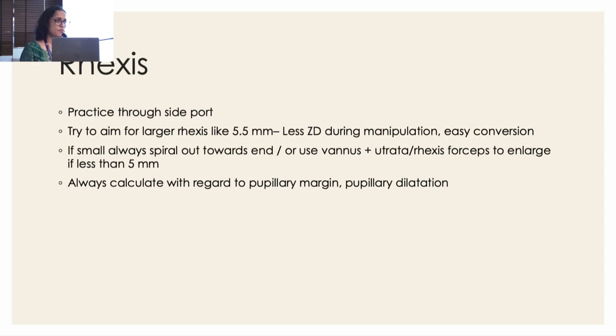If the rhexis is small, like less than 5 millimeter, never proceed, enlarge it with Vannas or rhexis forceps or Utrata. And always calculate the rhexis size with regard to pupillary margin, pupillary dilatation, and everything. Sometimes it will be very tricky. Always calculate in mind.